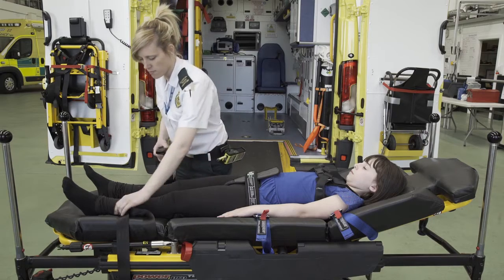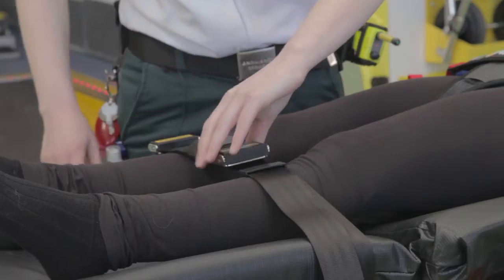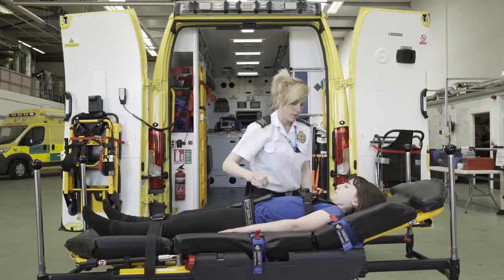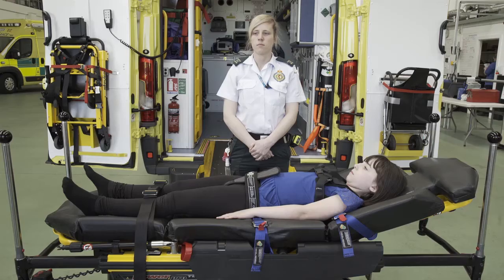For medium and large harness, secure the child's legs with the cot strap. Finally, tighten the four blue harness straps on the stretcher — pull each strap down to tighten. The child is now secure.